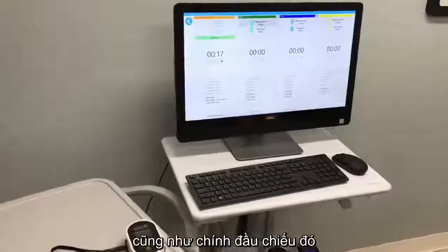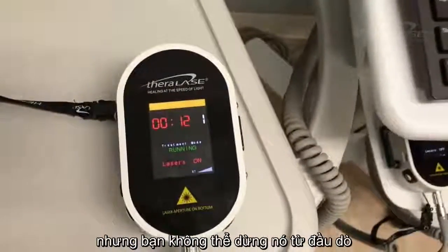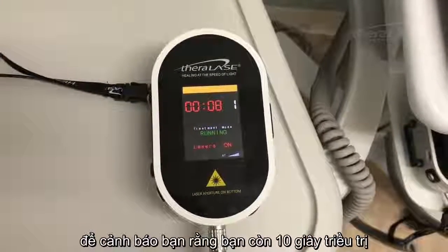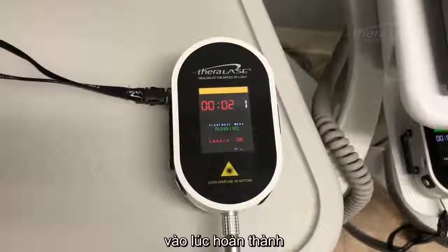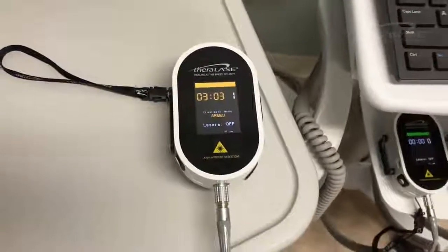On the probe itself, you can pause the treatment, but you can't stop it from the probe. To alert you that you are in the final 10 seconds of treatment, the probe will beep. The practitioner can set the volume of the beeping sound. Upon completion, the probe will reset back to the original time for convenience.